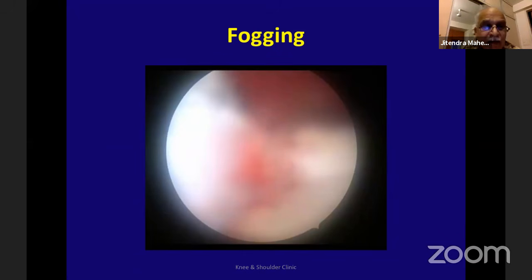So in that case, if you are really concerned, be prepared that you will work without a tourniquet, but you will struggle. If you are okay struggling, it's okay not to use a tourniquet. I'll still apply a tourniquet there and try to avoid using it. But if I'm struggling and I have to do that arthroscopic surgery that way, I'll put a tourniquet on. I think, yes, there is a theoretical risk of blocking the vessel, but in my opinion, it is theoretical. It really doesn't happen.